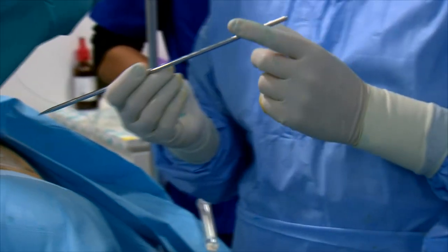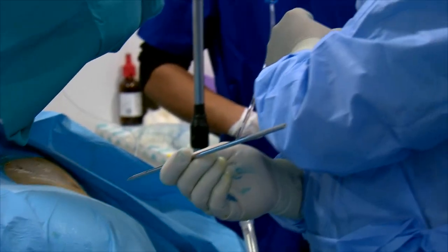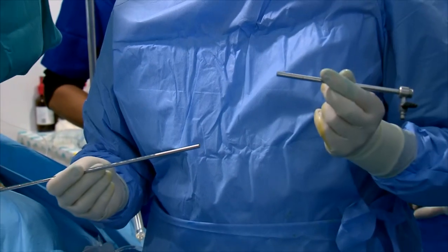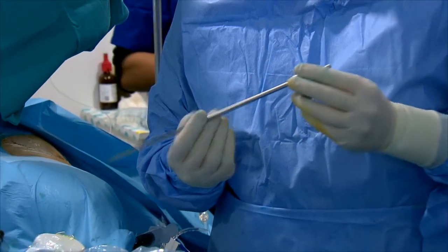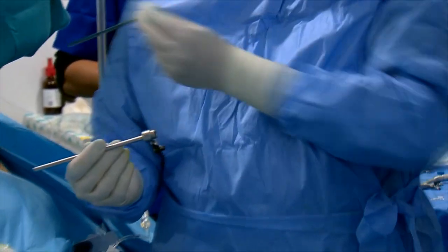And after you have forwarded this dilator, you take the Amplatz sheath. This is also stainless steel, and this Amplatz sheath exactly fits the stainless steel dilator. You are forwarding the Amplatz sheath and you are removing the stainless steel dilator.